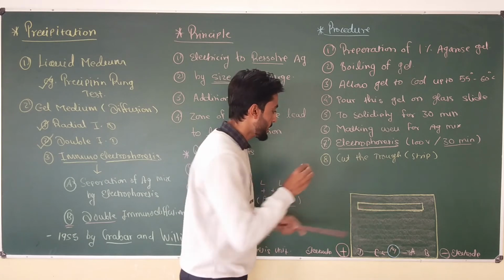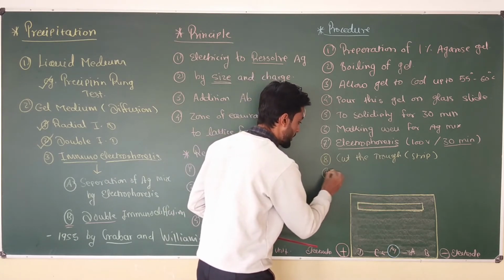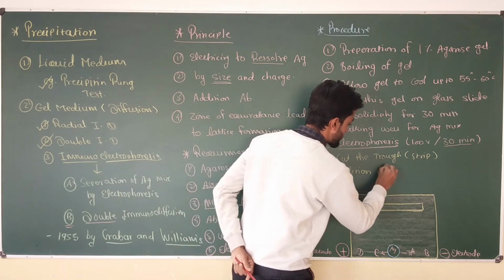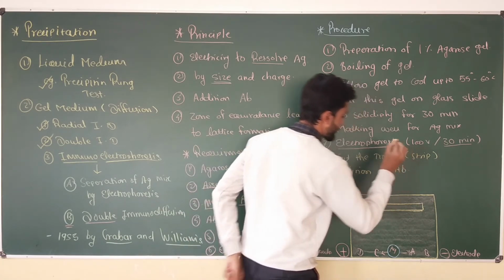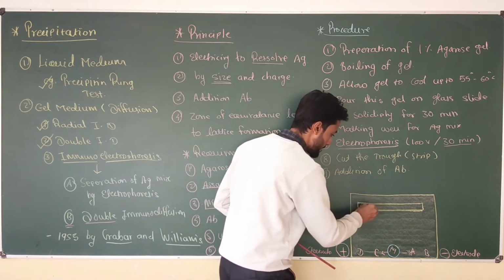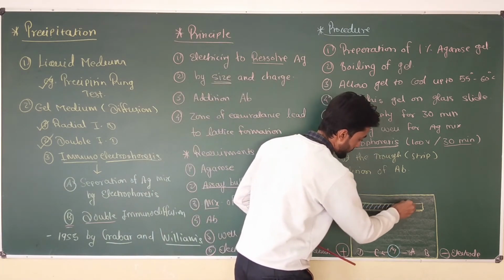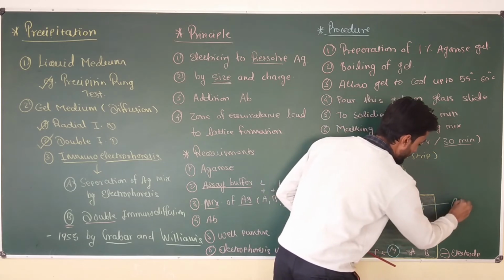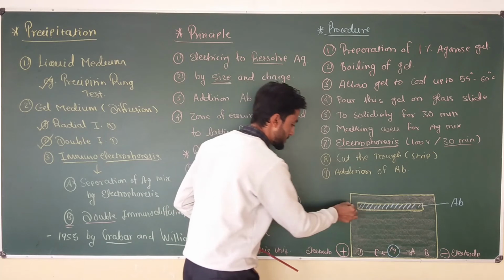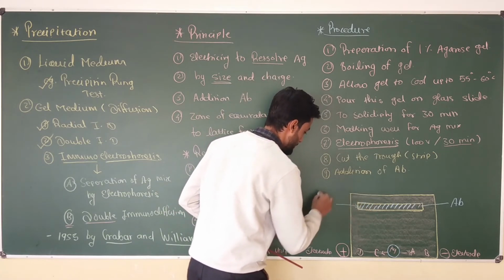And then the next step is addition of antibodies. Now we're going to add antibody specific for this antigen into this plate.